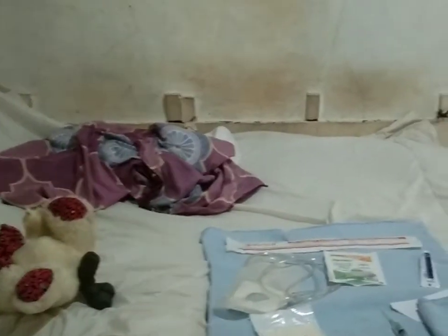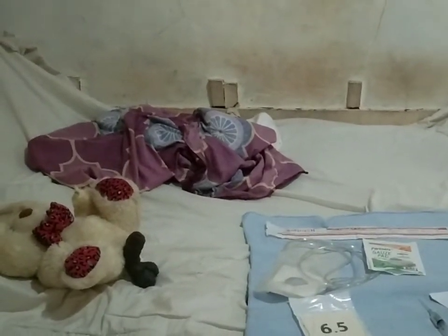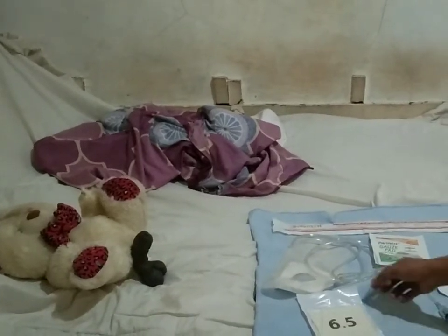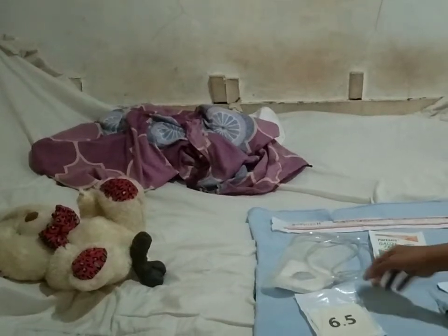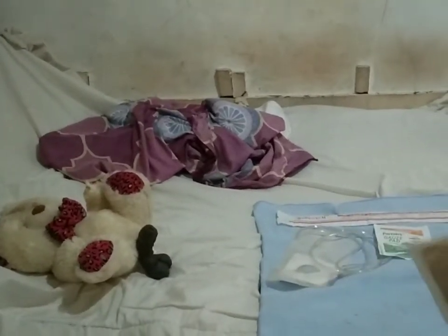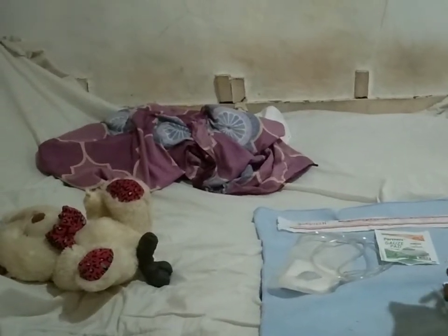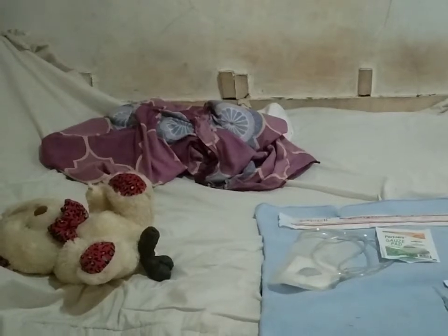So okay, now we will put on new gloves for the insertion. Keep this area sterile. We already performed hand hygiene. Okay, we will remove it and dispose of this.